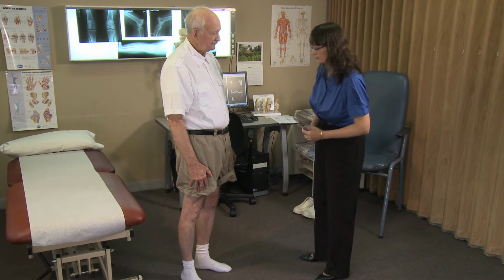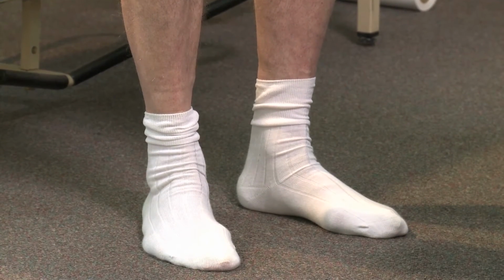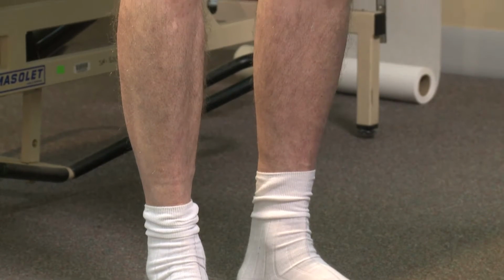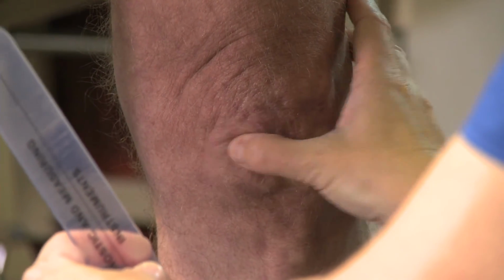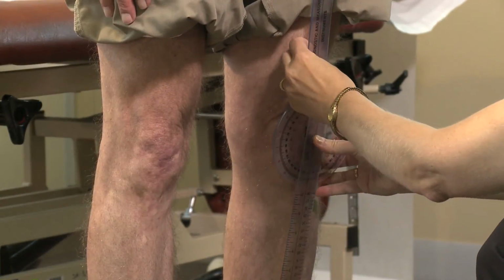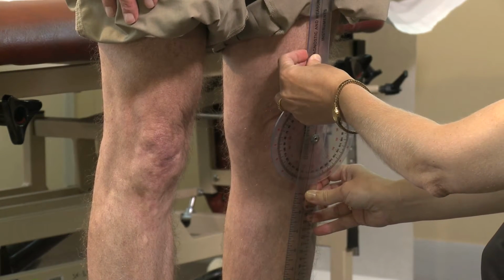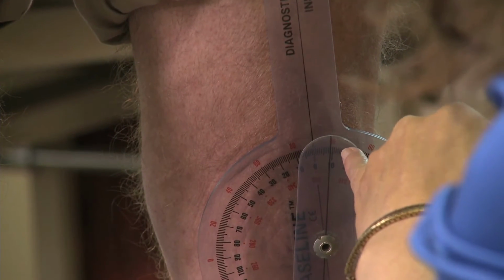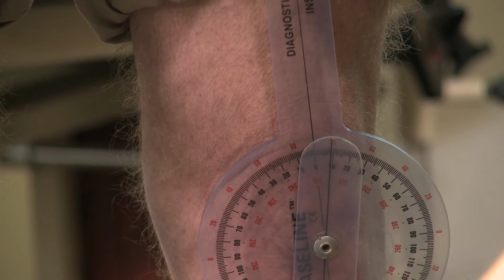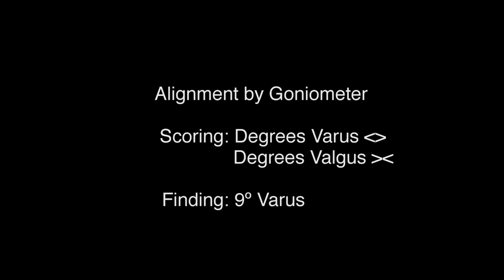Alignment by goniometer. The subject stands facing the examiner. The subject's feet should be approximately shoulder width apart so that the subject stands comfortably. Weight should be borne equally on both feet. The center of the goniometer is placed at the center of the patella. The goniometer is lined up mid-thigh above and along the patellar tendon below. The examiner reads off the measurement in degrees and takes note of whether varus or valgus degrees need to be recorded. 0 degrees can be recorded as either. Alignment by goniometer is scored as the number of degrees, varus, or valgus.